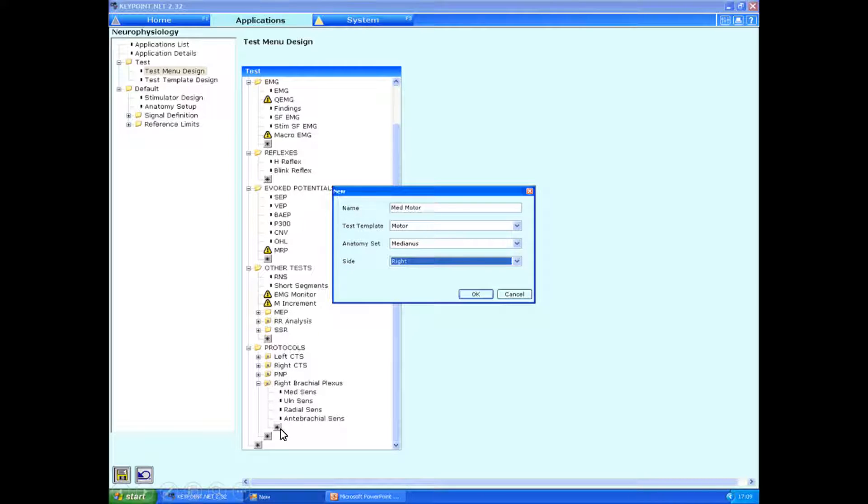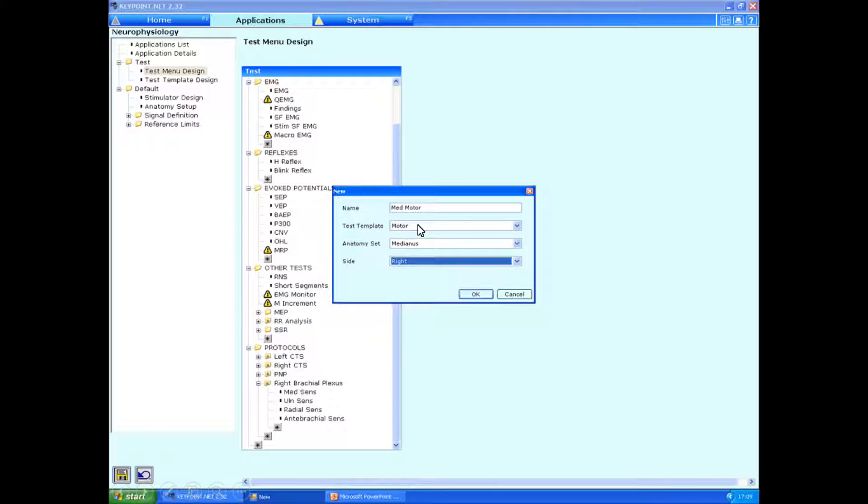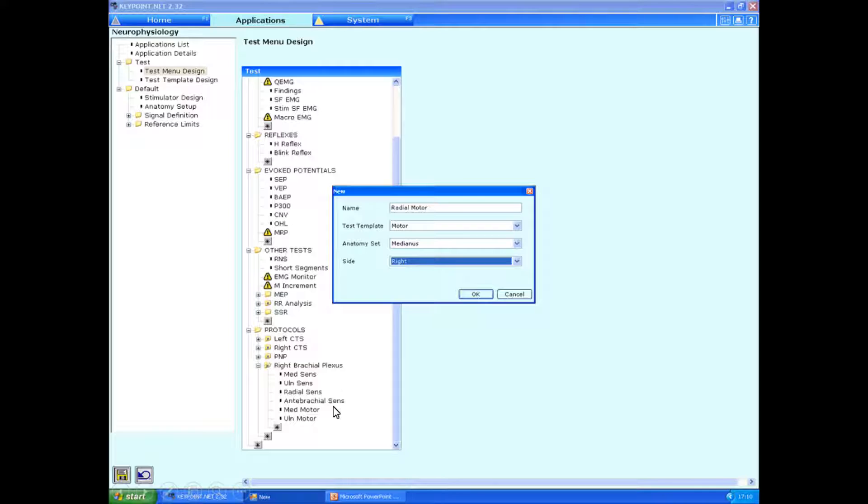Let's add in motor studies. So here, clicking still in the same group on the little star, and I've typed in median motor. This time, test template, we've selected the motor protocols from the median nerve set. And again, make sure it's on the appropriate side. And we're going to click OK. And we'll carry on doing this. So now we've got the median and ulnar motor studies in there.